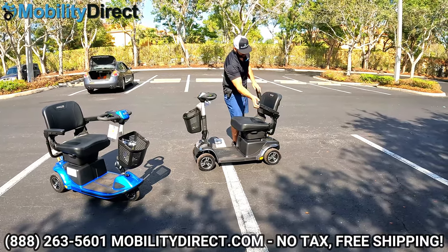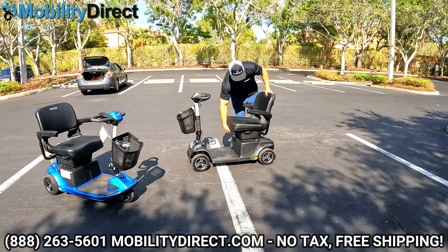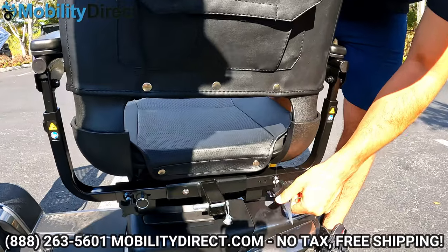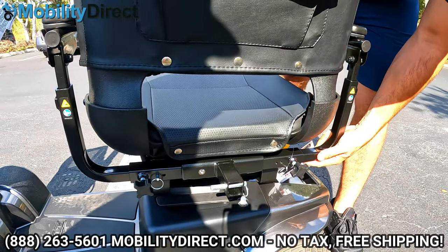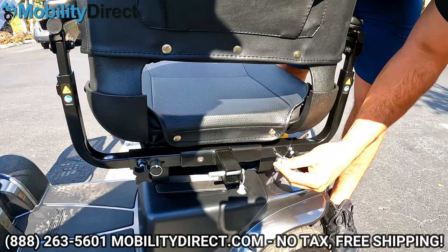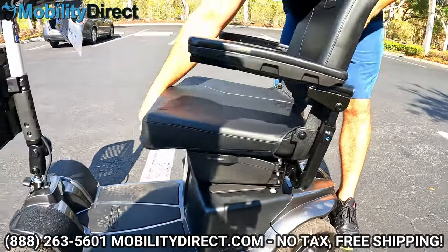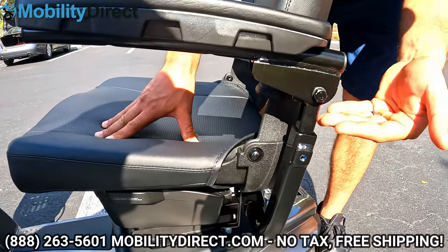You have flip-up armrests that are both height-adjustable and width-adjustable. On the back, there are a few hand screws and securement pins. You just take the securement pins out, loosen up the hand screws, and the armrests slide out or in to create more or less distance between them. For height adjustment, you need to use the Allen key that comes with your user manual bag — put it in the set screw and you can raise or lower the armrest height.